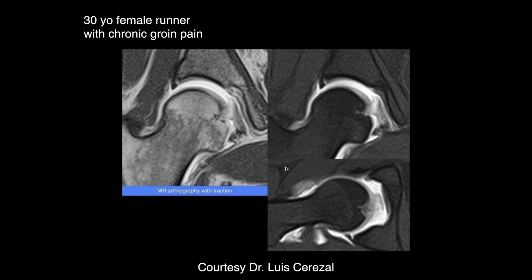A 30-year-old female runner with chronic groin pain. There is significant signal within the ligamentum teres. In the posterior labrum there appears to be some separation — possibly mistaken for a sublabral foramen, but posterior sublabral foramina are not typical, and this likely represents an injury. This is actually a common finding if searched for carefully.